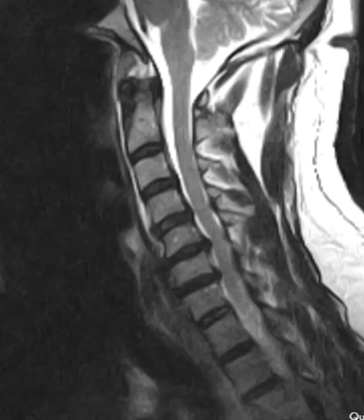This is a patient who had pain in the neck and the right shoulder. The main thing was the shoulder, and they wanted to find out what was causing the shoulder pain. They thought since the neck was hurting, maybe there was a disc herniation in the neck, but they decided to do both the shoulder and the neck at the same time because they didn't want to miss something in the shoulder.